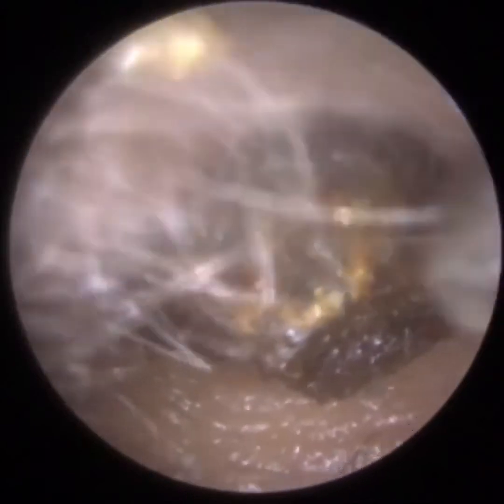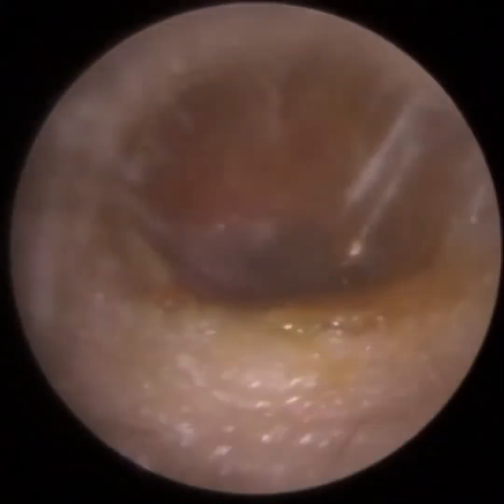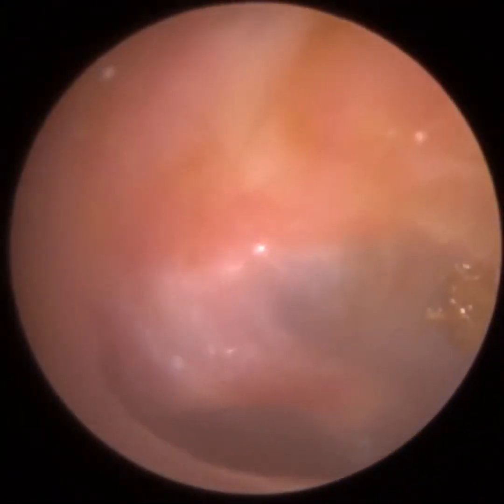So I've just advised the patient to attend more regularly. It's been 2.5 years since they last attended. You see the patient's got a very bendy, narrow ear canal. There's the patient's eardrum.